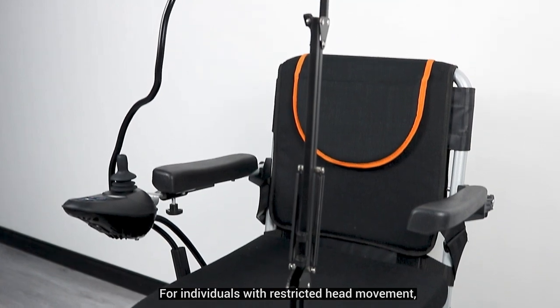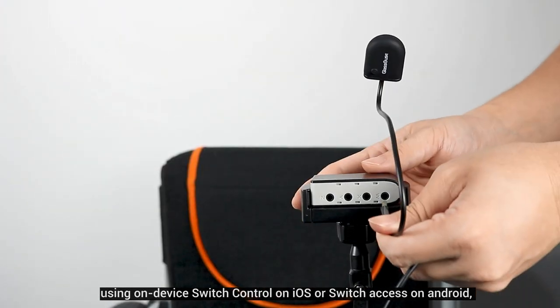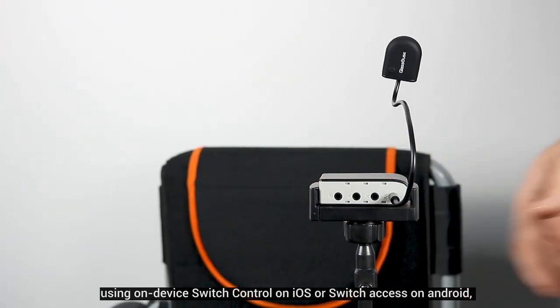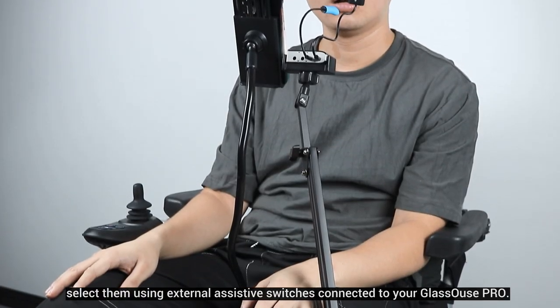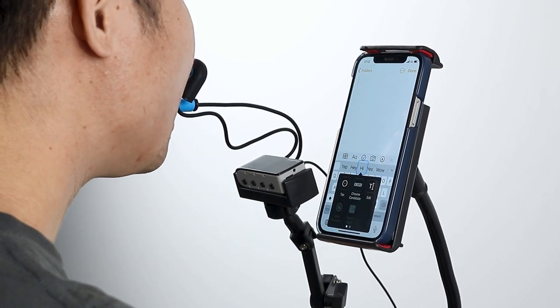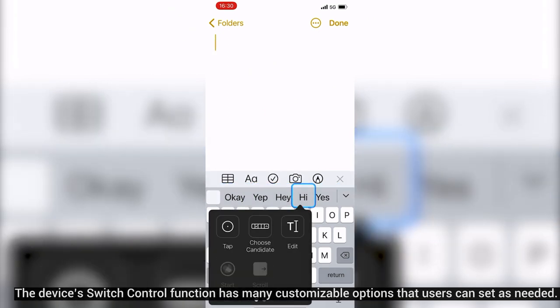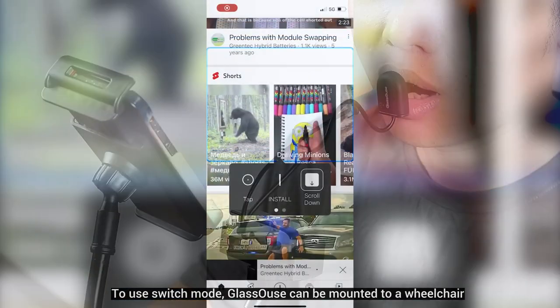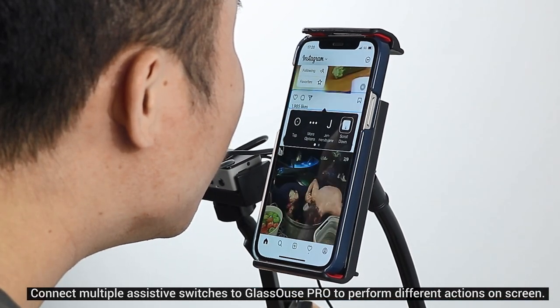For individuals with restricted head movement, GlassOuse PRO's switch mode lets them control their phone and tablets using on-device switch control on iOS or Switch Access on Android, which scans the buttons on your phone or tablet and lets you select them using external assistive switches connected to GlassOuse PRO. The switch control function has many customizable options that users can set as needed. GlassOuse can be mounted to a wheelchair using a special attachment or simply worn on the body.